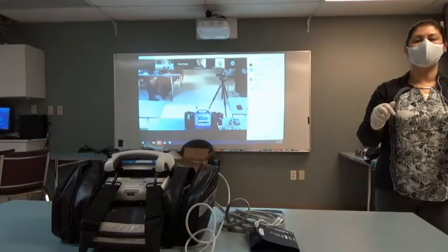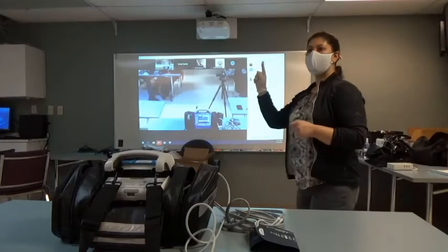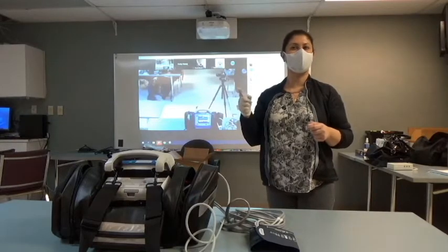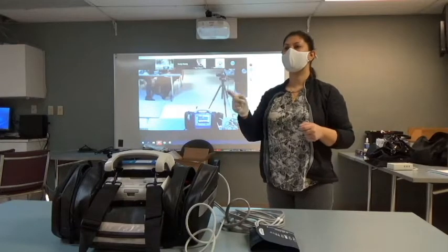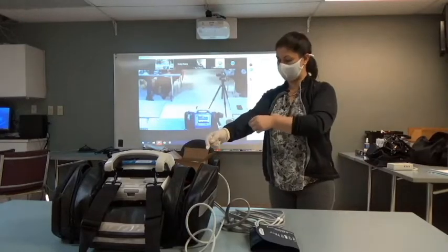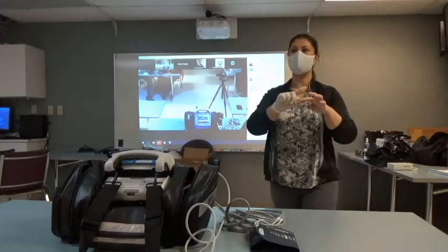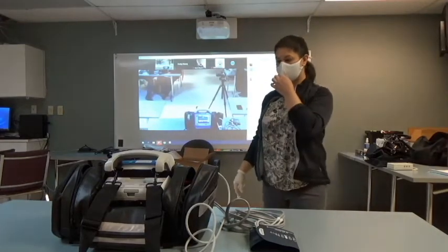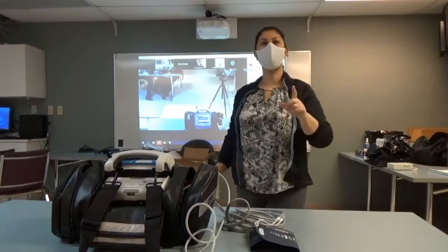When you put the pulse ox on, you'll see your oxygen saturation up at the top. Below that, it'll take a little bit longer, but you'll get that PI number. Can you guys remind me what the perfusion index number should be? One or greater. And then you'll get carbon monoxide right underneath that. Everybody see that? Okay. Just remember, if you go to take your pulse ox back off, be prepared to hit the alarm silence button.